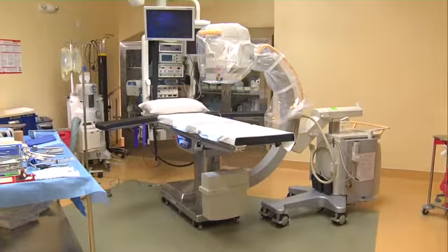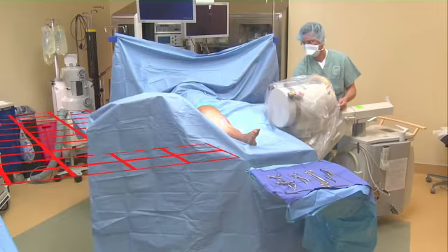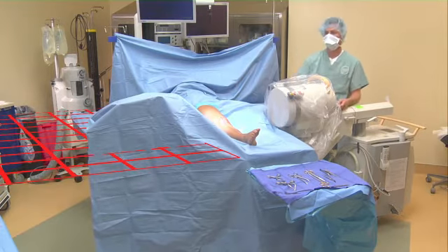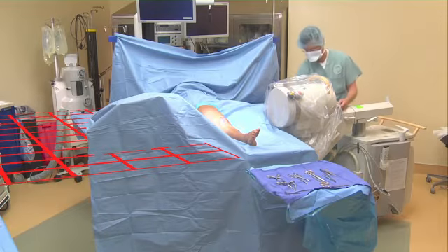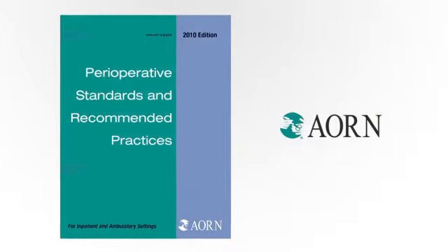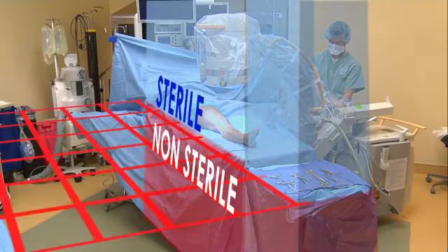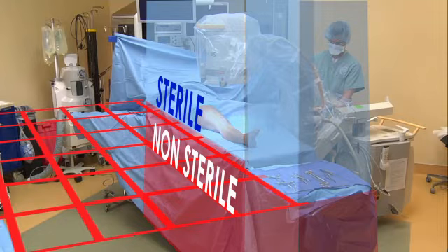The C-arm X-ray tube breaches the sterile field boundary during a surgical case, rising from beneath the surgical table to a lateral position adjacent to the patient's surgical site. The Association of Perioperative Registered Nurses defines the sterile field boundary as the horizontal plane at the level of the waist or the surgical tabletop.